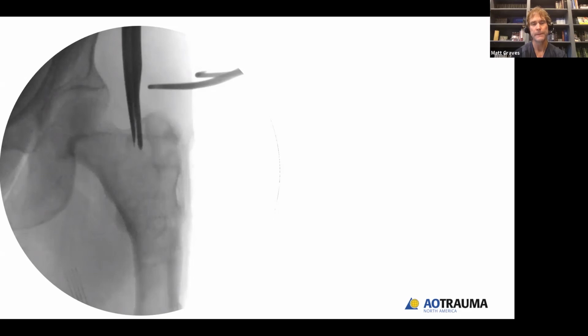Hey, Matt, one other thing, and everything's a little more concerning in the tibia for this osteotomy. The other thing to think about, and I think Steve might have a comment on this too, is that this is an acute correction. One of the things that I'm nervous about in the femur is any of these acute corrections, and the clamshell will let you correct crazy angular deformities acutely, is a situation where you're going to put some tension on a neurovascular structure.